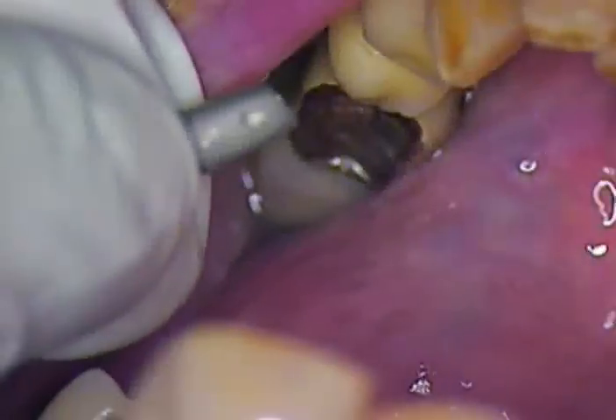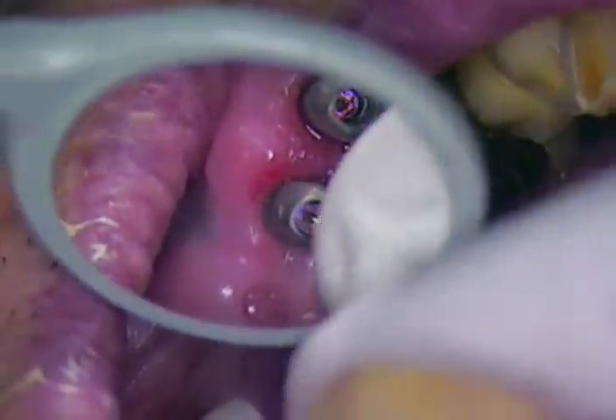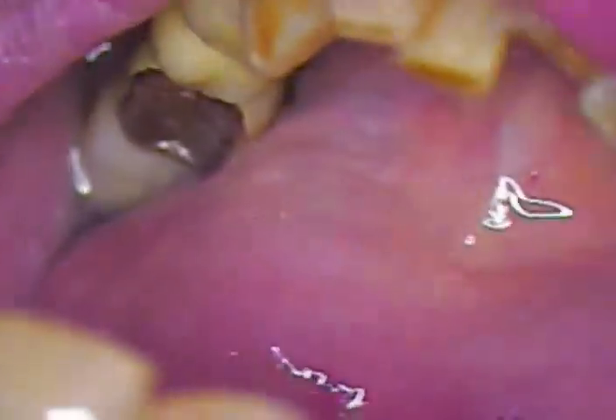Nice response to the tissue — no collapse whatsoever. We'll put our next abutment in. See that little mark right there on the facial aspect of this abutment? You've got to get your lab to do that. It saves you lots of time when you're doing multiple cases like this, because sometimes all these abutments start to look alike. If your lab marks the outside and marks the model — for instance, that's a dot and this one's a slash — so you know which ones go where.